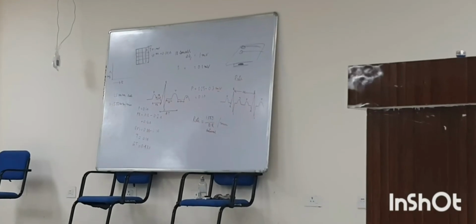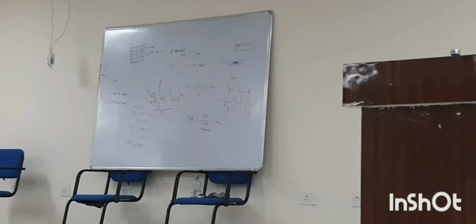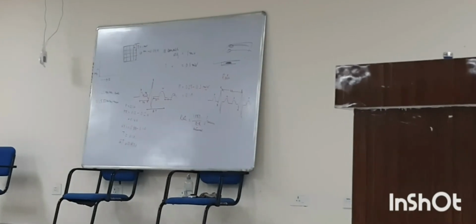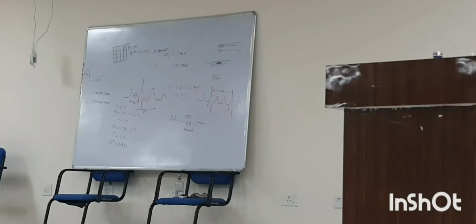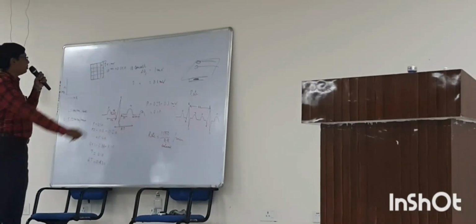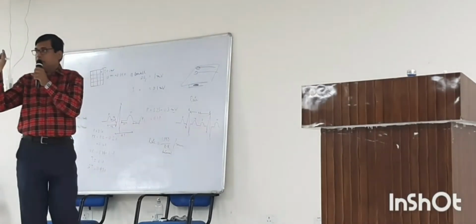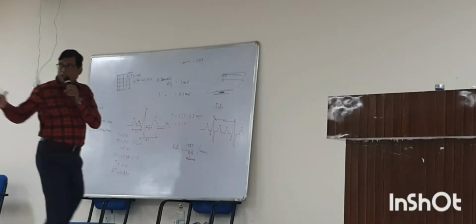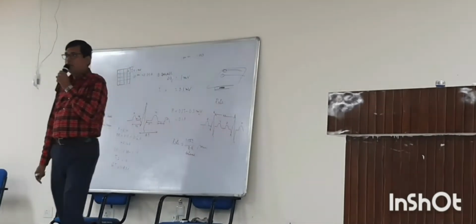In 1 minute, it can travel 1500 millimeters. And the distance between two successive R waves can be calculated by counting the small squares.